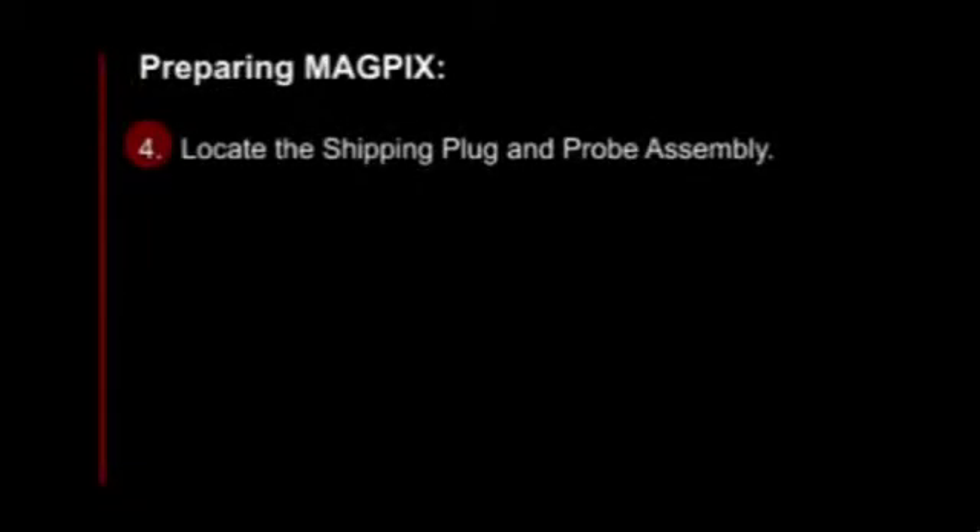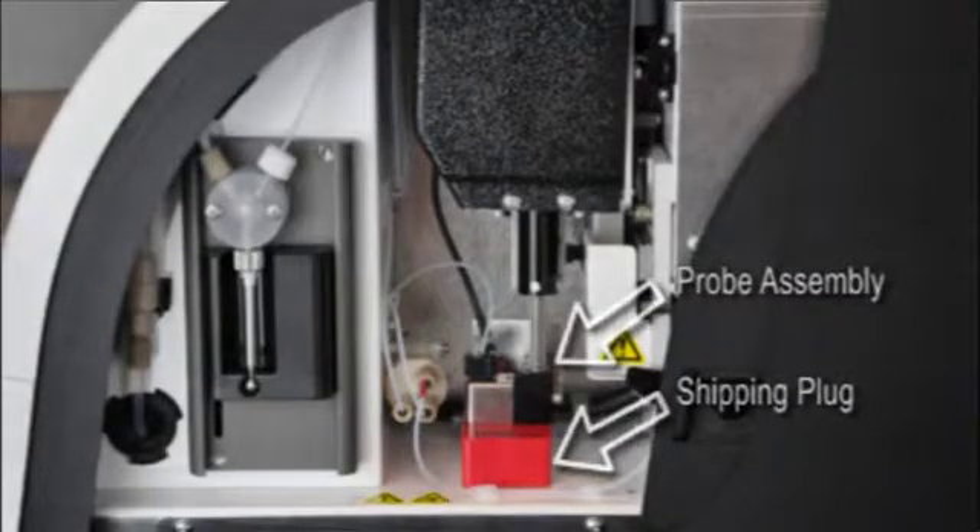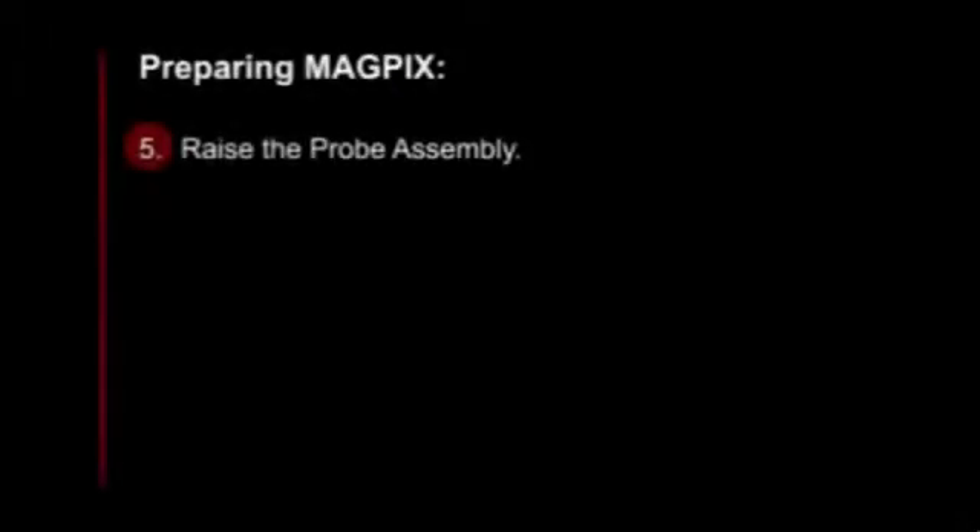Fourth, locate the shipping plug and probe assembly. Your fifth step is to raise the probe assembly.